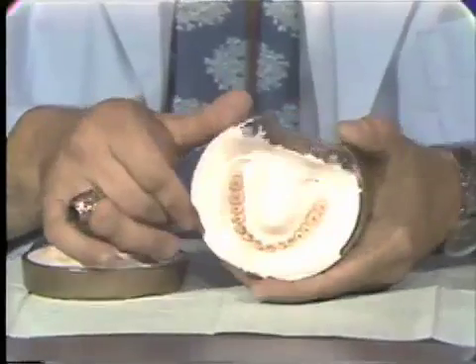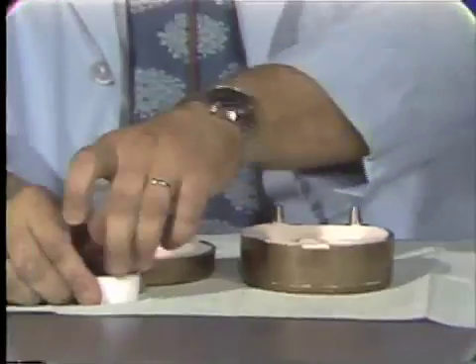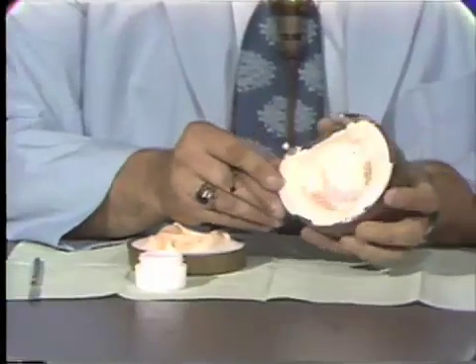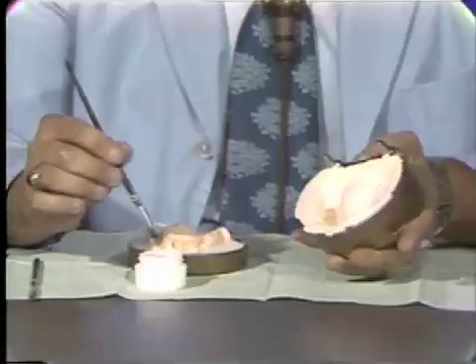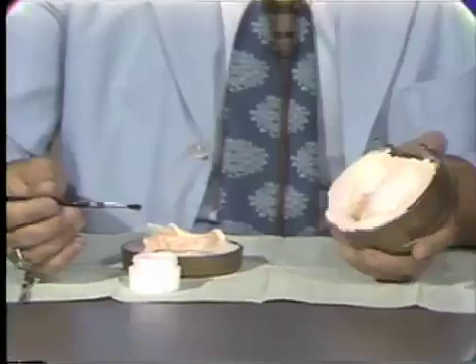Lusitone will retain its packability for a considerable length of time. So I will set this to the side and we will proceed with placing a separating media over the stone surfaces of our flask, our mold. To do this, we'll be using a product called Alcote, A-L-C-O-T-E. It is an alginate material that is painted over the surfaces of the stone so that the resin will not adhere to the stone after it is processed. I am going to proceed only with the maxillary denture at this time and I will show you what this looks like as we paint the material onto our stone.